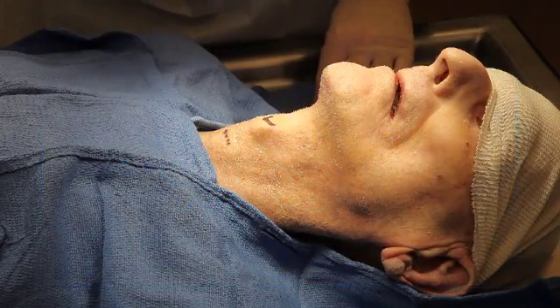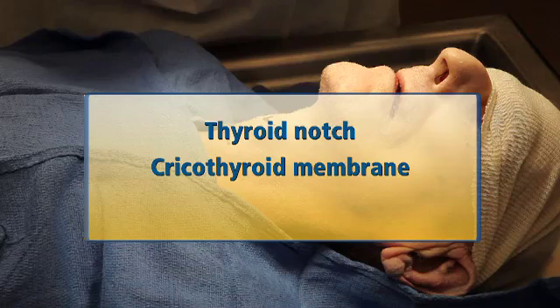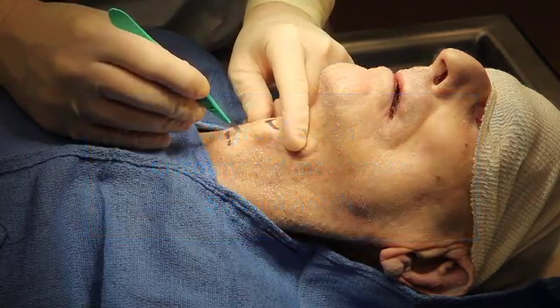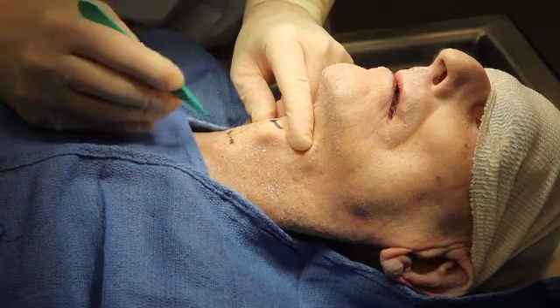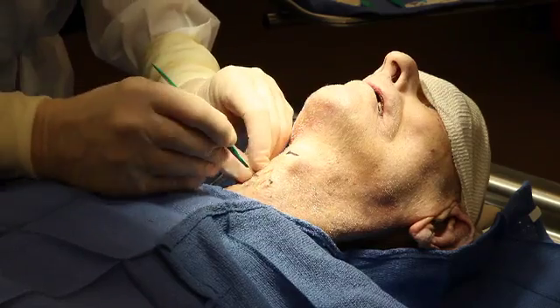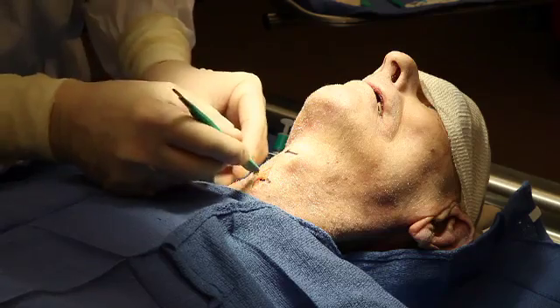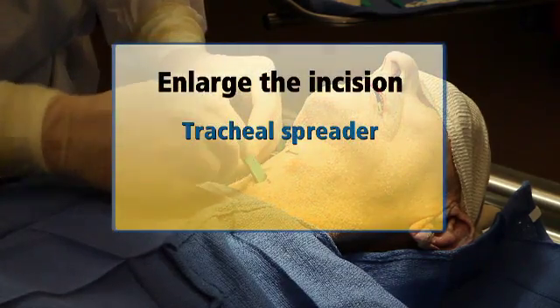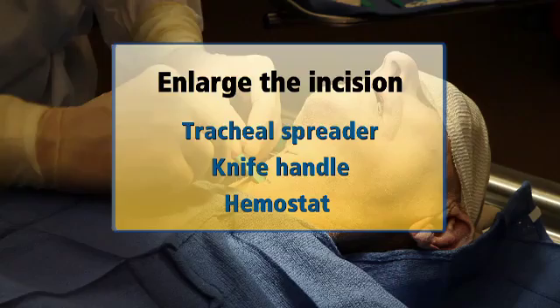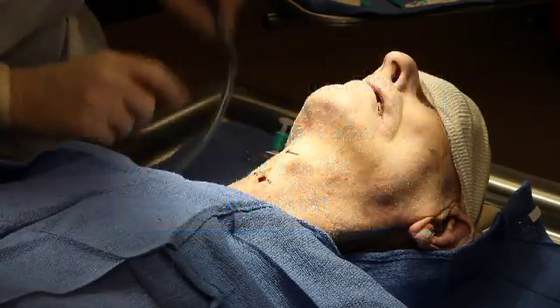The appropriate landmarks should be identified to include the thyroid notch, the cricothyroid membrane at the bottom of the thyroid cartilage, and the sternal notch. A skin incision is made over the cricothyroid membrane, which is then incised transversely, taking care not to damage the cricoid or thyroid cartilages. The incision in the membrane is enlarged by gently inserting a tracheal spreader, knife handle, or hemostat into the wound and spreading or rotating to open the airway.